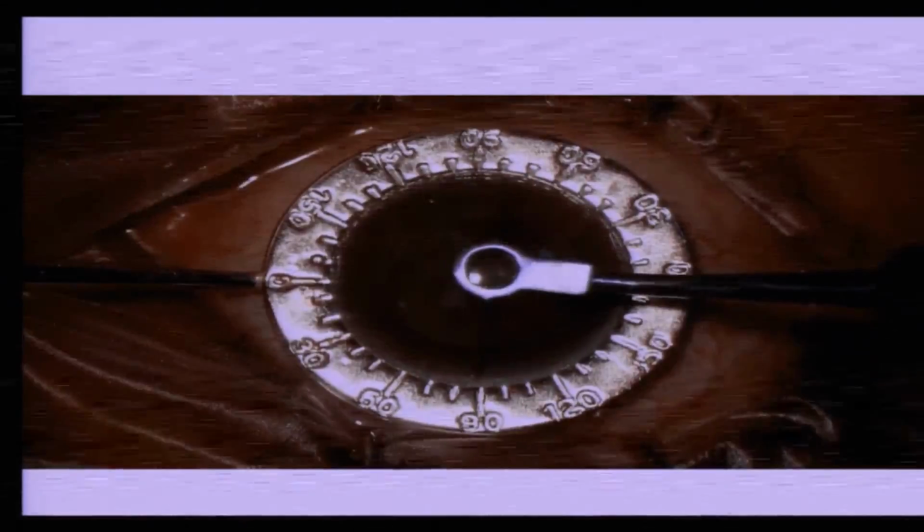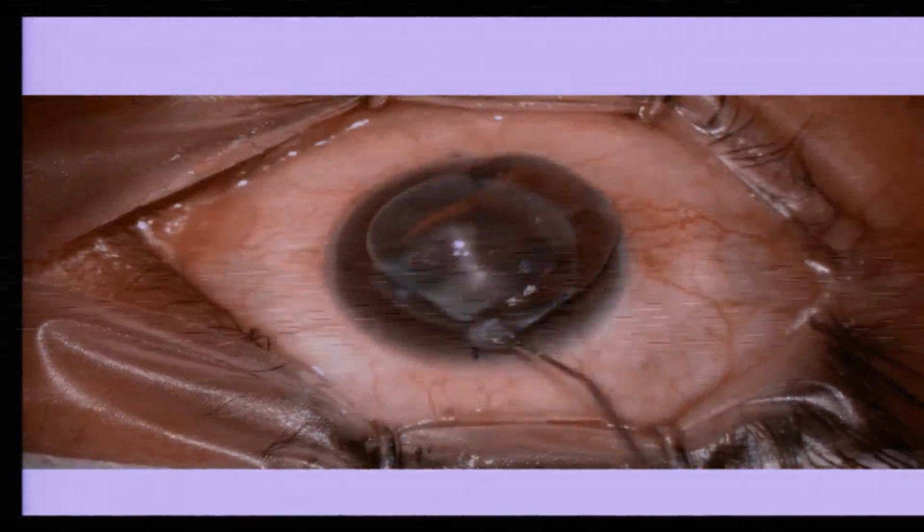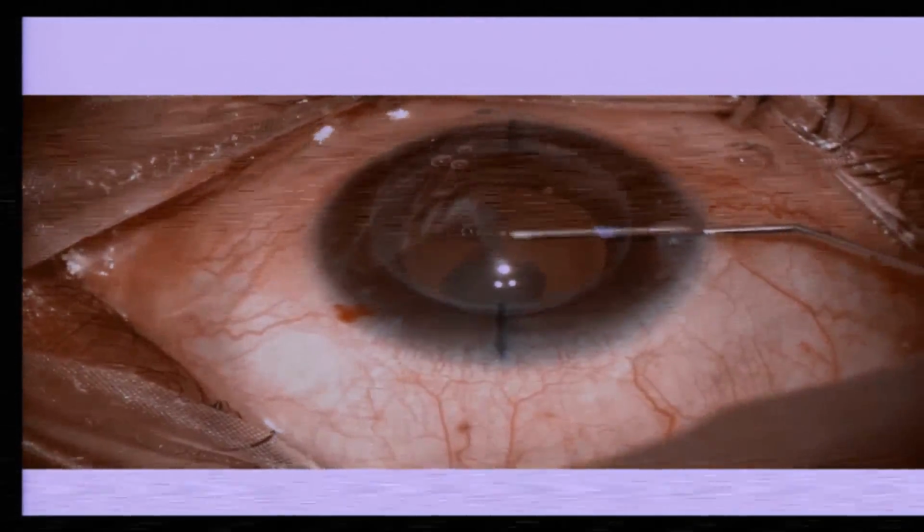The surface is stable, has astigmatism. We are planning on a toric IOL, so we do mark the surface, mark the axis of the toric IOL alignment. You can see it's mostly a posterior subcapsular cataract arising from possibly the steroid therapy that's been given over time. We put some methyl cellulose on the surface to protect the epithelium.